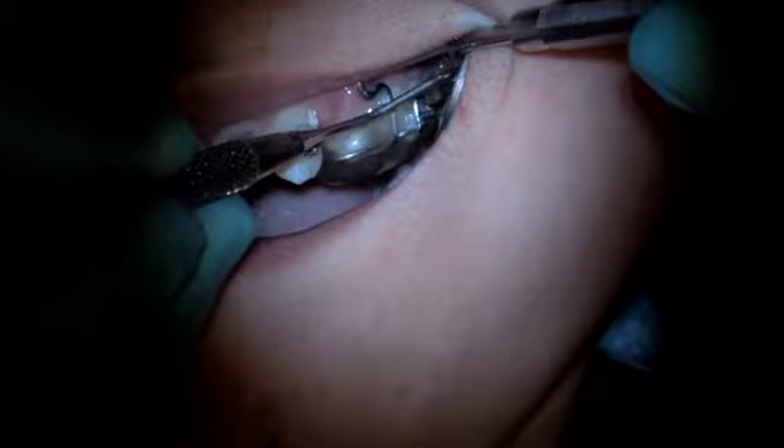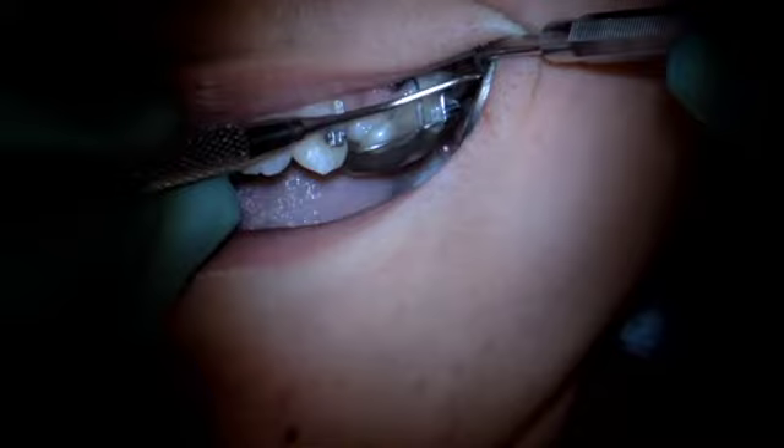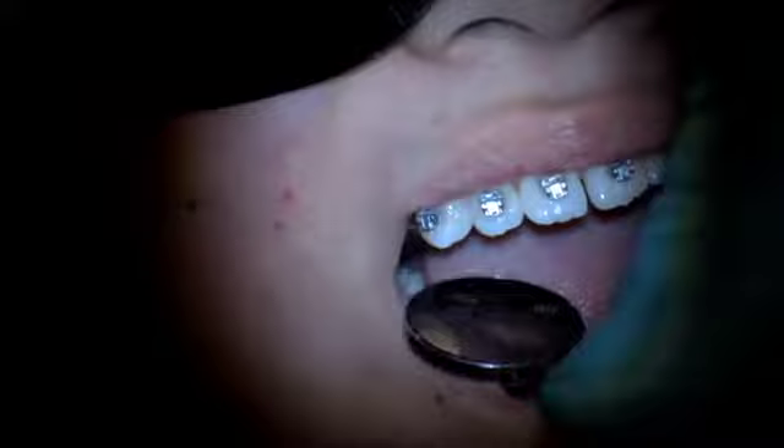If there's not an undercut in that region because of excess glue, sometimes it's worthwhile getting a high-speed handpiece with a diamond burr or tungsten carbide burr and just cutting a groove to give you some purchase point — called a sluice groove — to remove the hyrax. And on the other side as well, the same region.